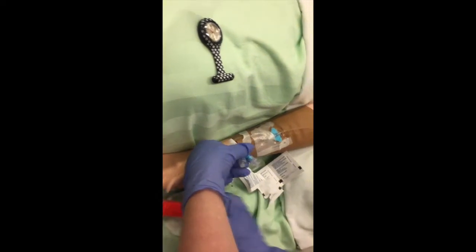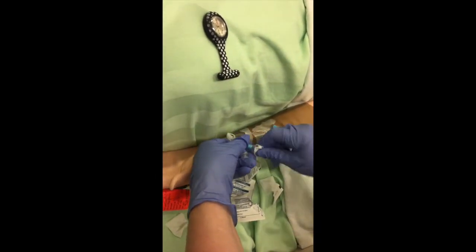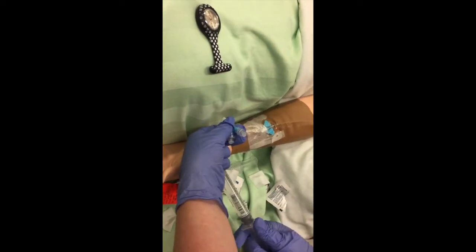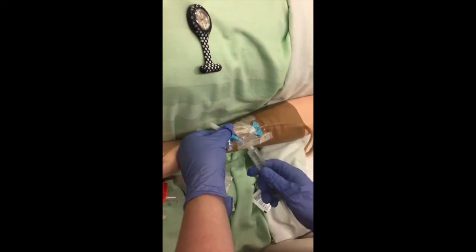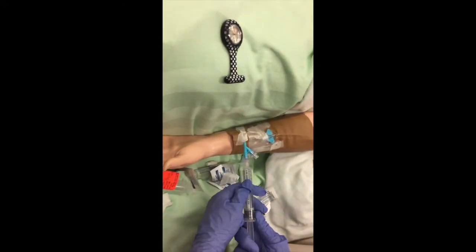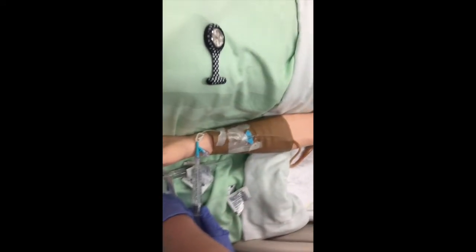Now I need to flush the port again with another ml of saline over 1 minute, cleaning for 30 seconds. Making sure the seal is broken. Touched a little bit there, so I would clean again for 30 seconds. Okay, so I'm going to give 1 ml over 30 seconds now. Or sorry, 1 ml over 1 minute.